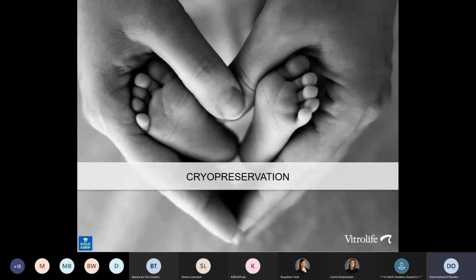Vitrification of day 5 embryos is almost essential to give sufficient time for the genetic testing laboratory to accurately test the embryos, and also for the patient to take some time to wait for the embryo transfer, and to give the embryologist and doctors time to assess the results and accurately determine which embryo has the highest potential to transfer.